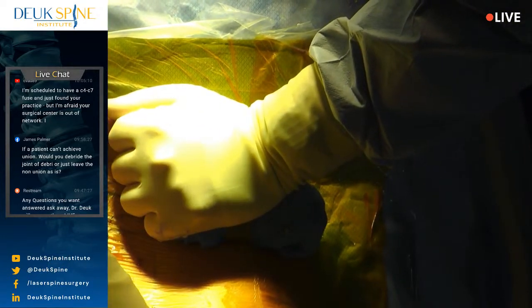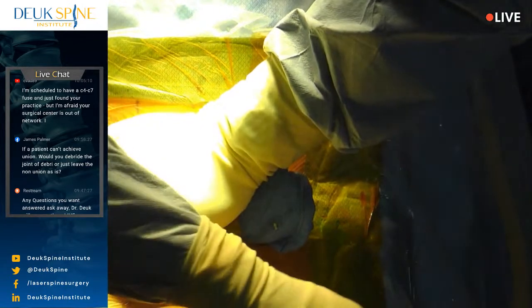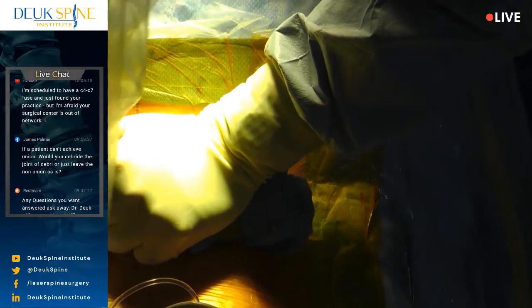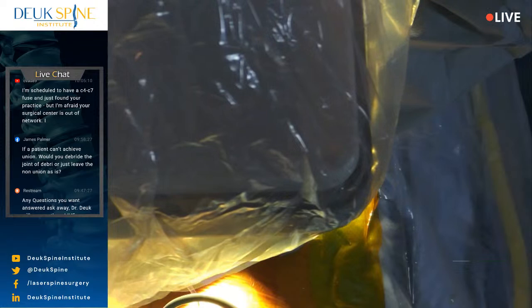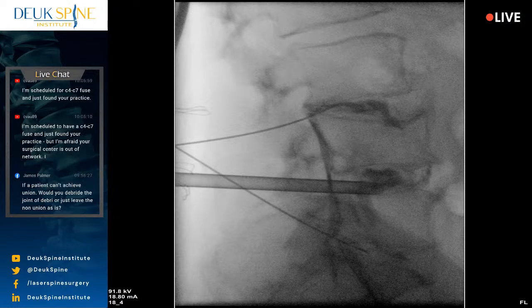All right, so we finished the L4-5 left approach. What we found was that, yes, there was a tear. There was a herniation through the tear. The tear was low-lying. It was along the bottom of the disc. It was not a huge tear. It was a small tear, but it was still causing inflammation and pain and pressure on the nerve root. So we cleaned it up, and that should take care of that one.